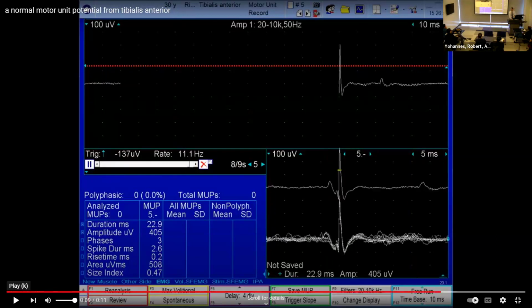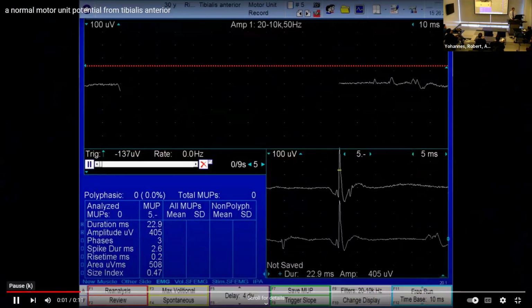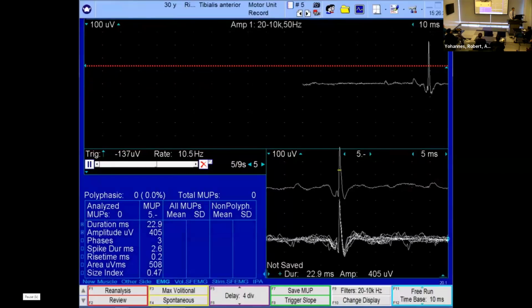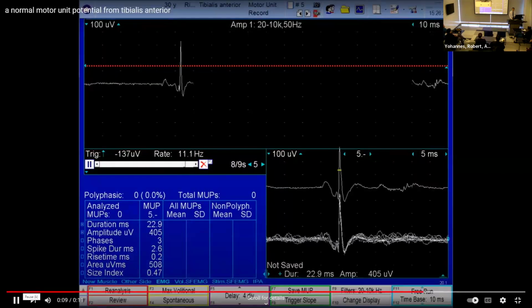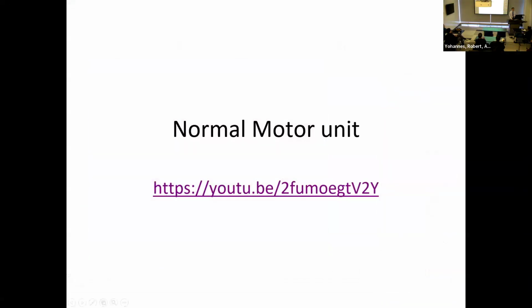So again, very rhythmic, pump, pump, pump, pump, but not these low frequency thumps of the drum, and not the high pitch raindrops. Okay. And yeah, that's basically what I want to say here. So that's normal. Let me have you listen to it again, so you have this kind of normal in your mind. That's normal.